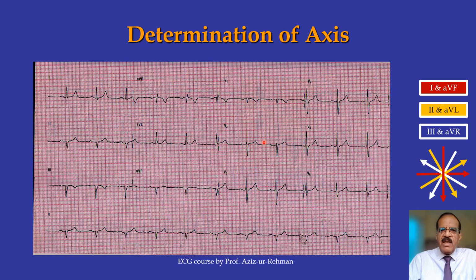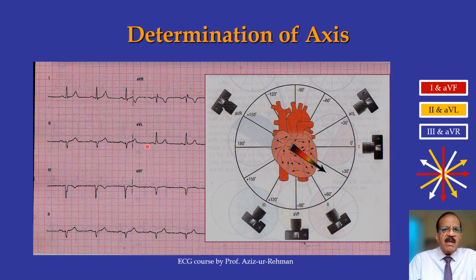So this is another ECG and we cover this part, and let's see which of the 6 leads we have isoelectric. Yes, you're right, here, AVR. Okay, AVR has got an isoelectric or biphasic QRS complex. So AVR, and AVR is this one. It is written here, but you should remember by now that this is AVR.